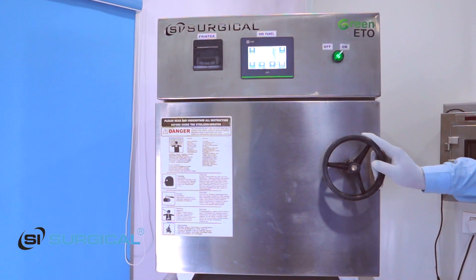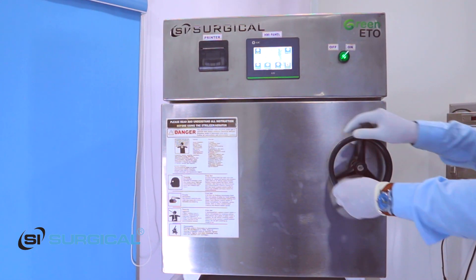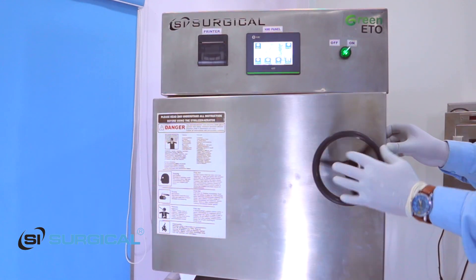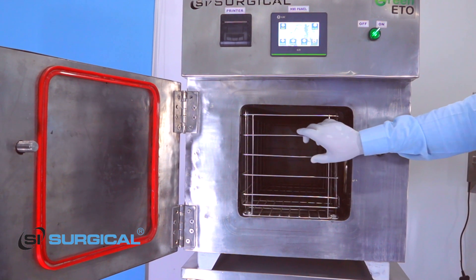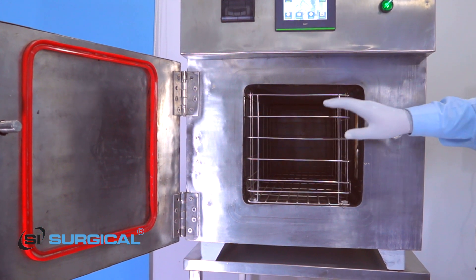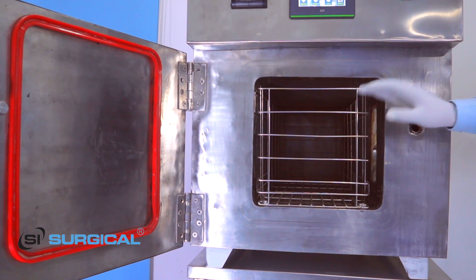We have to open this gate by moving this lock to this side. This is our inner chamber and this is the ETO basket to load the instruments. We have to fill this basket up to 75% for perfect sterilization.